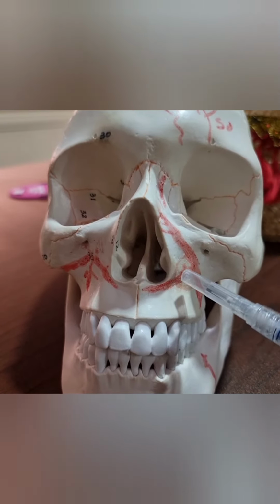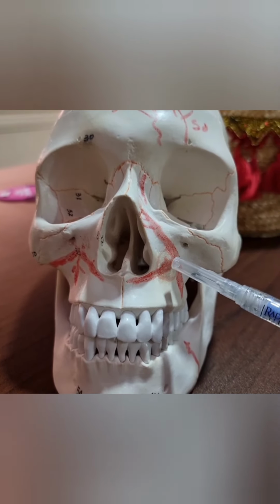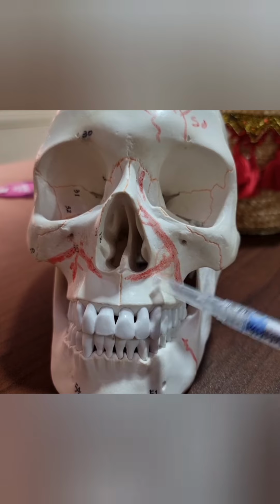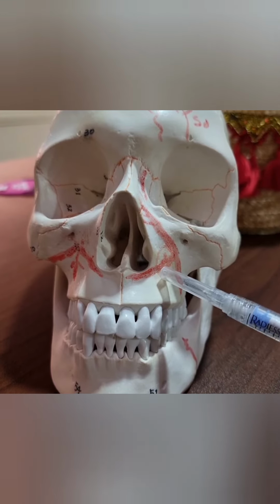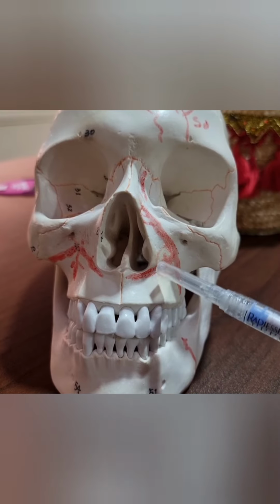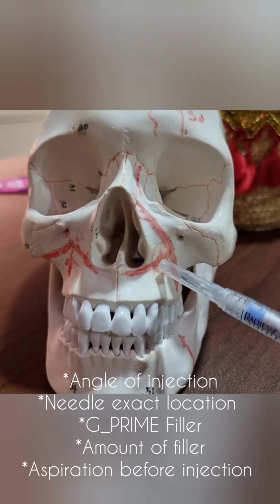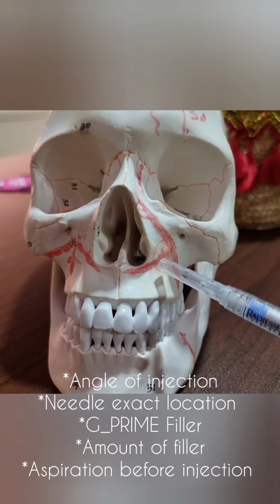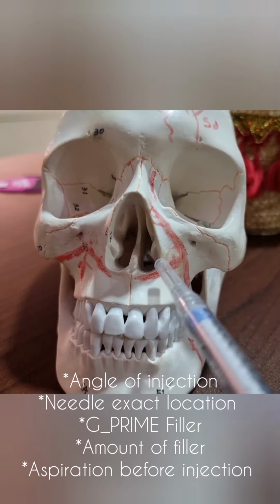رقم 3, must respect the amount of filler you're injecting here. Only inject about 0.2 to 0.3, never ever a larger amount in the same session, عشان ما تعملش indirect pressure على الـ facial artery and it makes ischemia لا قدر الله. So I must aspirate. رقم 4, it's good negative, not good positive, and thank you.